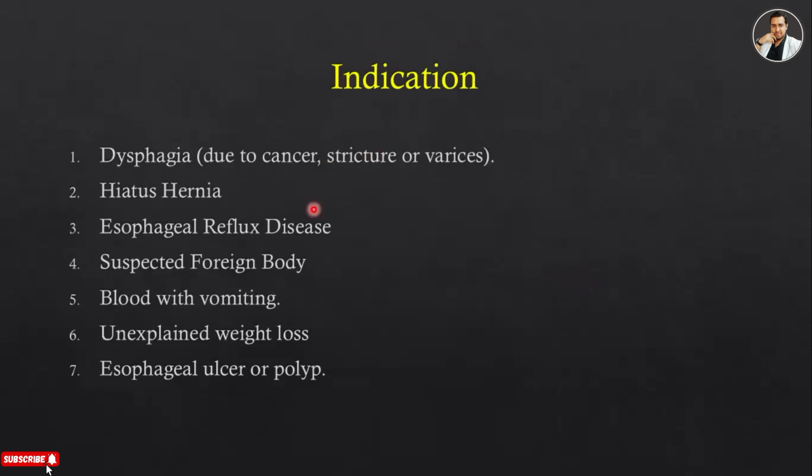And now the indications. What are the indications and when does the doctor advise this barium swallow? So the first one is dysphagia.